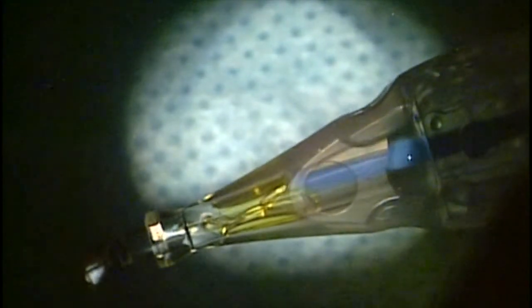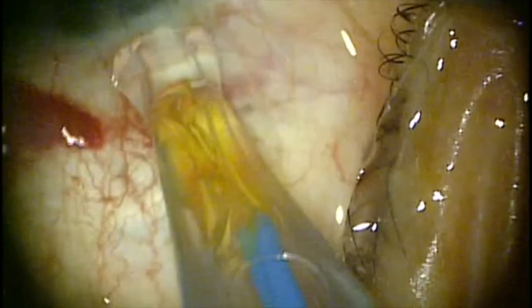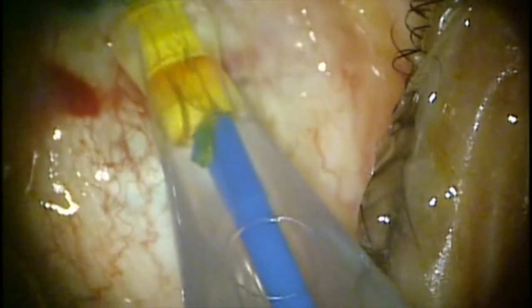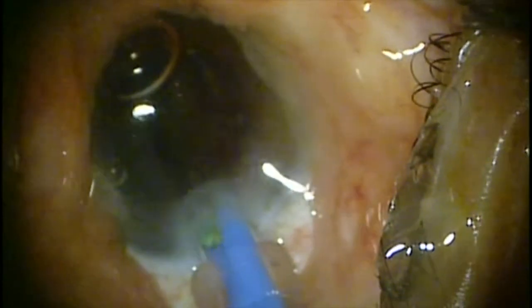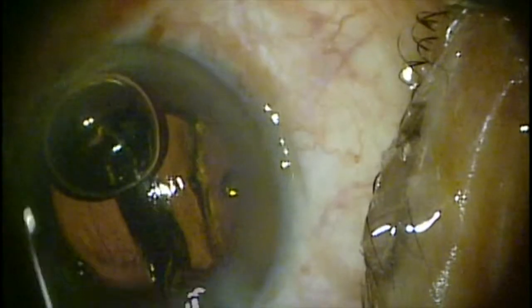The second instrument acts as a barricade to prevent the haptic from going forward and pushes it back into the proper position. Here we can see that same lens is now in the proper configuration as it goes inside of the eye.